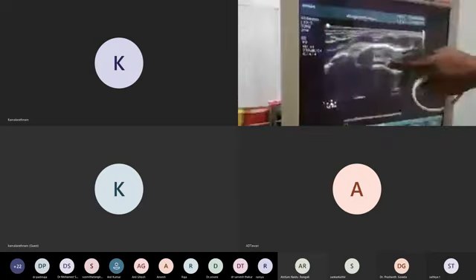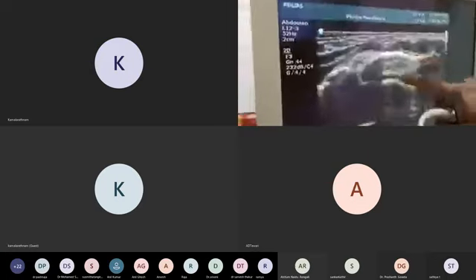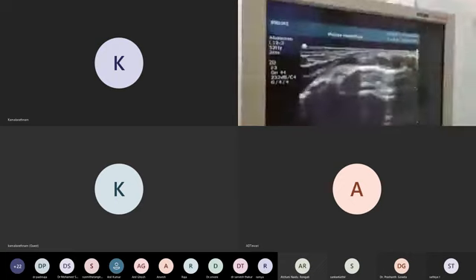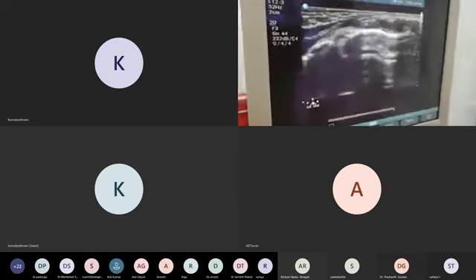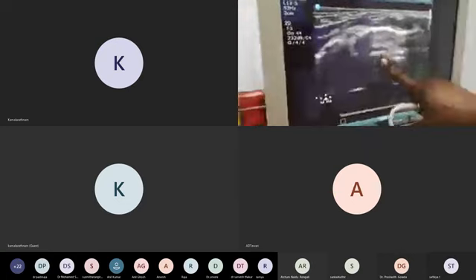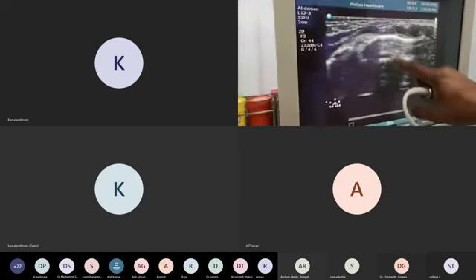That fluid will come to the surface of the pleura. If alveolar pathology is there, that time the pleura will have a lumpy, bumpy appearance. You understood why the pleura is thick, and the pleura will tell indirectly there is some pathology exactly below that. You understood. So suppose more fluid is there, what happens?